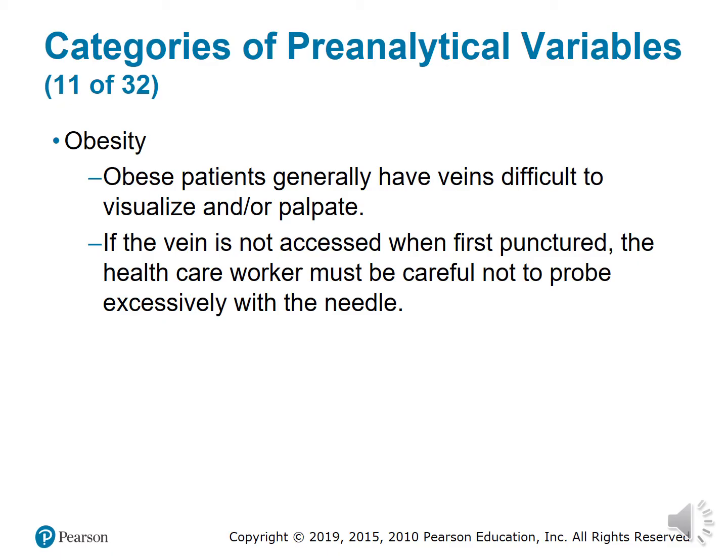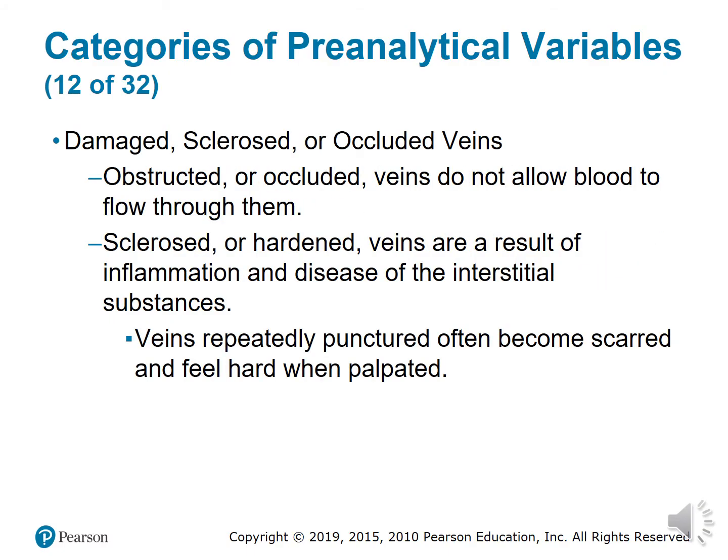And I'm not saying all obese patients, because some obese patients have very good veins and some have poor veins. It just depends on the person. So everything you hear about an obese patient is not always true. It can be very stressful for the healthcare worker as well as the patient sometimes when we have trouble finding the vein. Most times the obese patient knows the best site to draw from, so it is always helpful to ask the patient where is the best place to draw, because the patient knows their body better than we do.